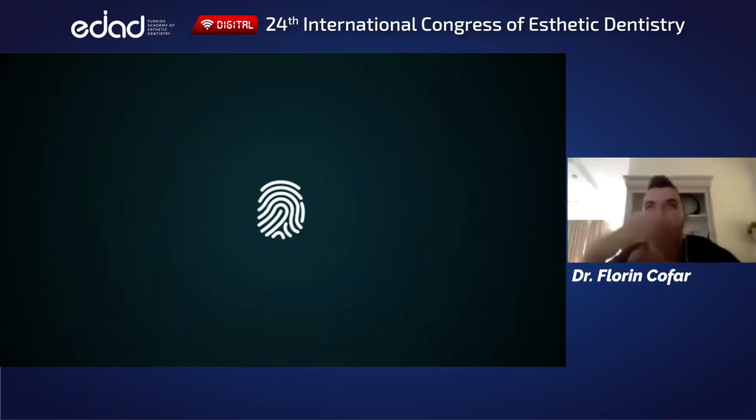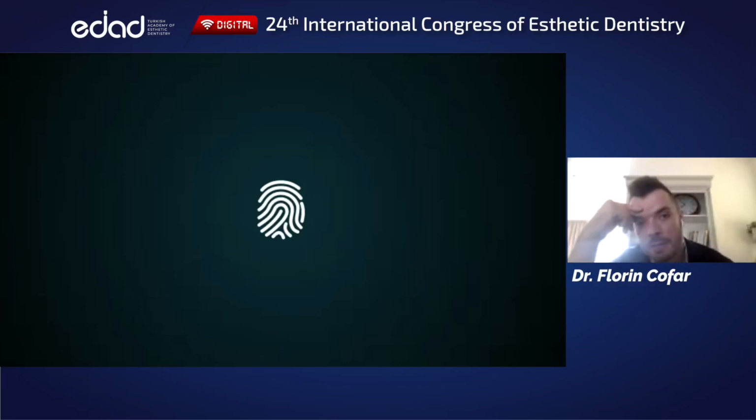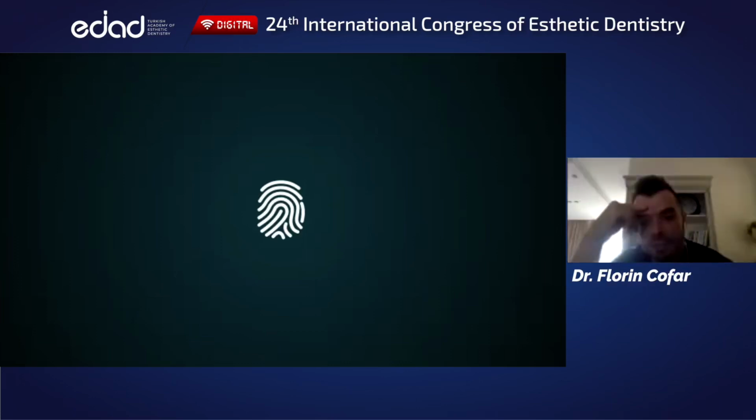Let me put it this way: libraries, if I am to make a comparison, in analog, the basic unit of design is know-how. You have to imagine how a tooth looks like if it's missing, and you rebuild it using your vision, your skills, your experience, or if there's more, or if you rebuild a smile, etc. Now, in digital, the basic atom of design is a shape.